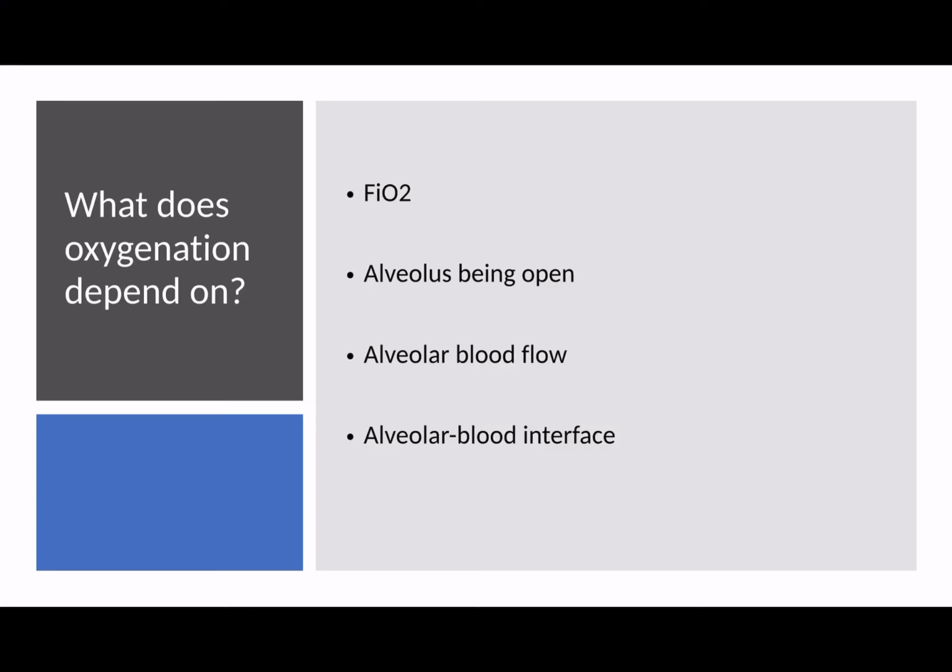As such, optimizing cardiac output and reducing pulmonary vascular resistance are important. Now, this is especially important in ventilation modes such as APRV, where you're increasing the intrathoracic pressure for a longer period of time during the respiratory cycle. And the patients are seeing much higher pressures than you would do with conventional ventilation throughout that respiratory cycle.